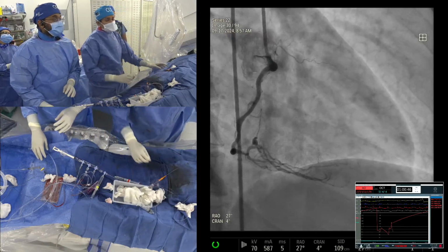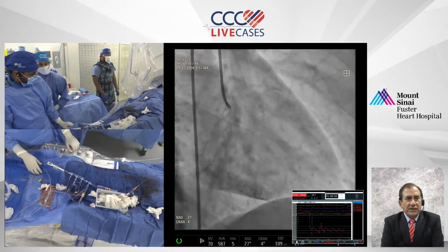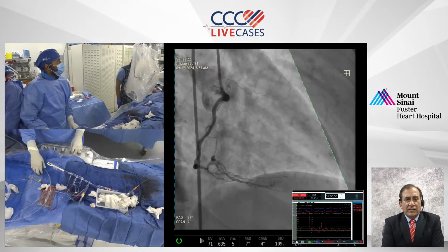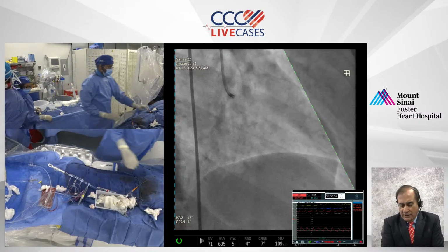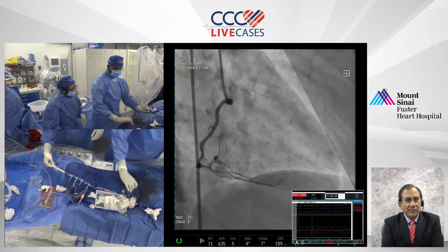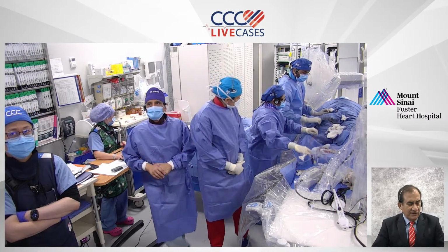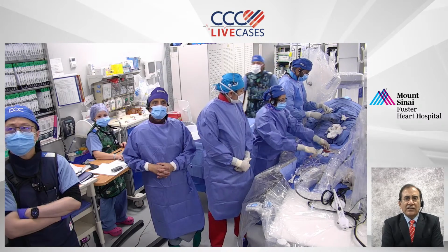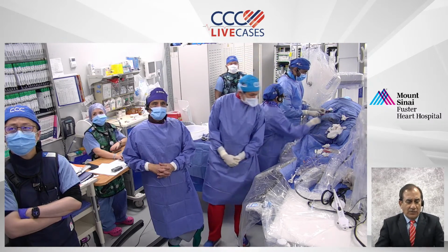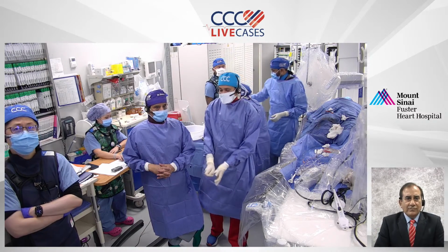You were asking me a question. Often we have seen you put a balloon in distally at low pressure to augment the flow and patch up the little intimal disruption. Would you consider it here, or no? Based on the results from OCT, you're happy to leave it? Based on the results of the OCT, I'm happy to leave it.